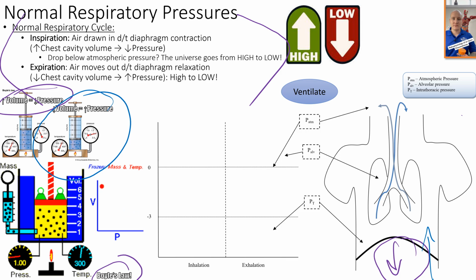Our waveform is going to look like this on the monitor, and also our ventilators. So we're able to see the waveforms. Oh, that's where they took a little breath, right? Because we create a negative pressure or positive pressure initially when we inhale. We create a negative pressure, right? So when I misspoke, that was a mistake. I self-correct because, oh, no, you create a negative pressure first, right? So your diaphragm goes down, makes the volume in the chest go up, right? And that increased volume is going to reduce the pressure overall in the chest, right?